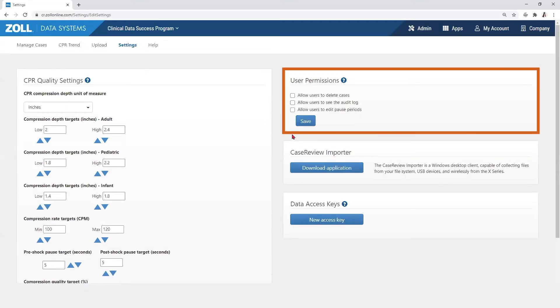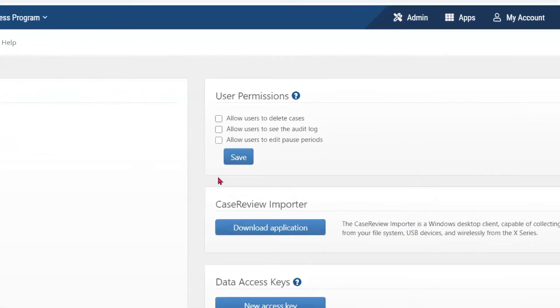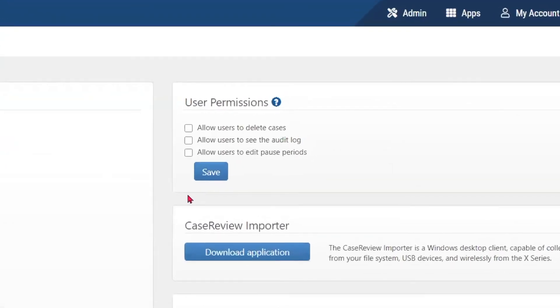User permissions, when checked, allow specified users to delete cases, see the audit log, or to edit pause periods.